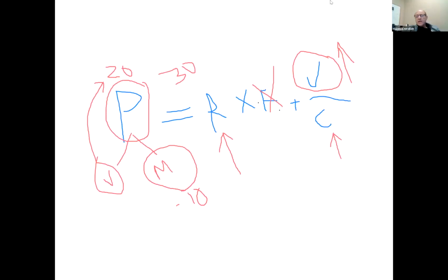So for you as an intensivist, it is really important that you understand this equation here. You cannot understand mechanical ventilation without full understanding of the equation of motion. The pressure on the left side equals resistance multiplied by flow plus volume divided by compliance. In volume control mode of ventilation, we control, let me just stop the simulator.